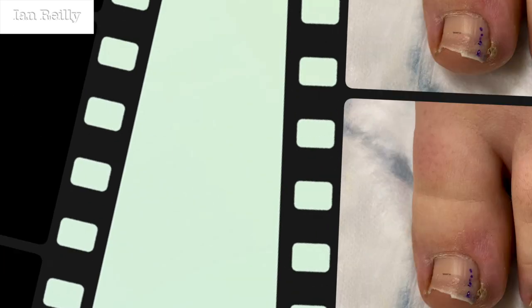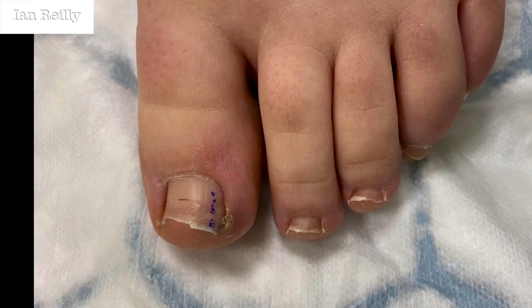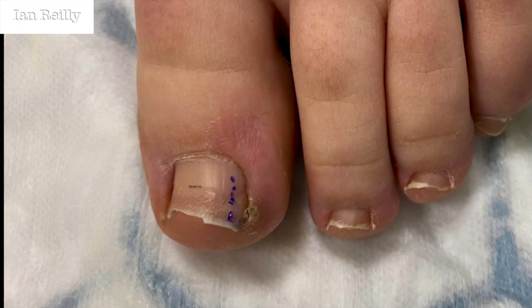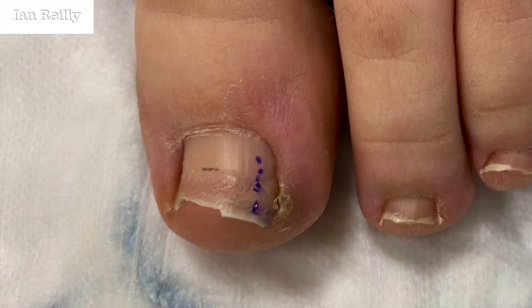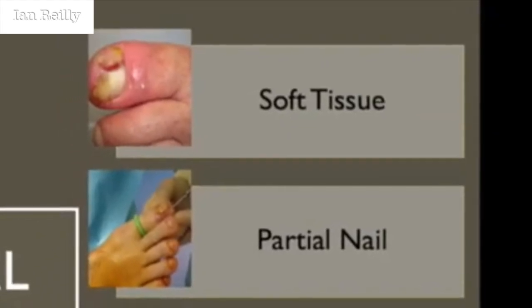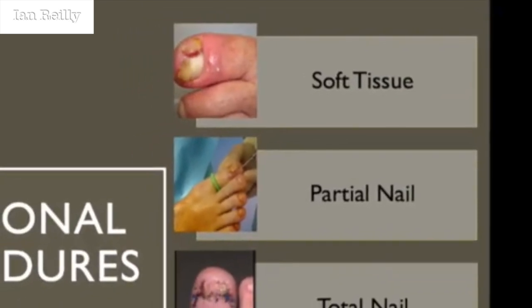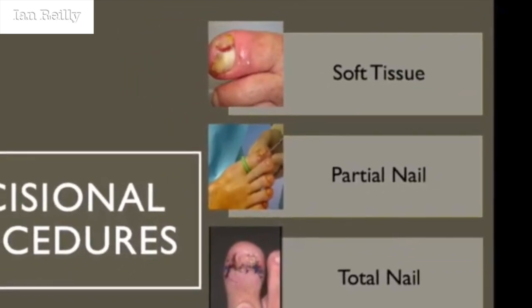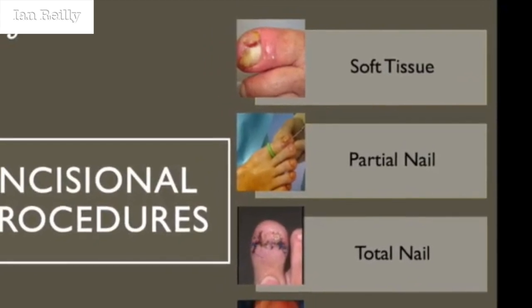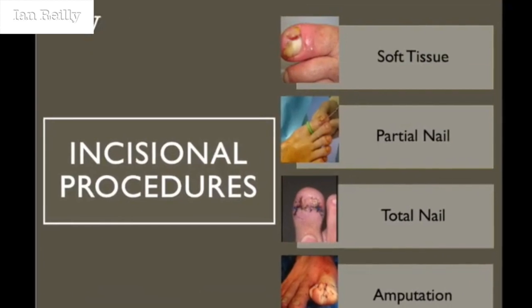Nail surgery technique coming up with what would probably be most accurately called the Bose procedure. This patient had had nail surgery done twice before, done very well by a local GP, but had regrown. I'll put a link up at the end. I've done a few videos now on incisional nail procedures where I use soft tissue and/or phenol techniques in combination. This one is a soft tissue Bose procedure without phenol.